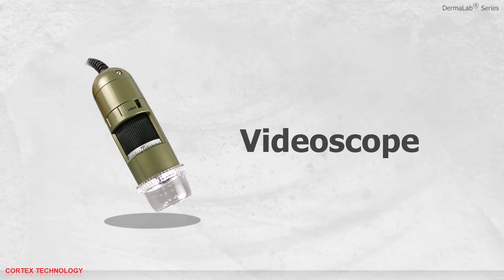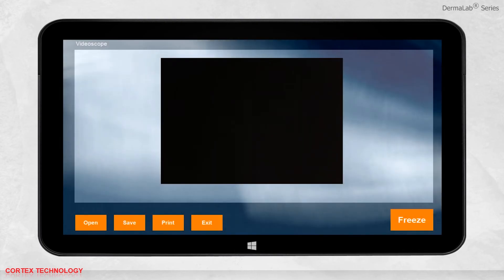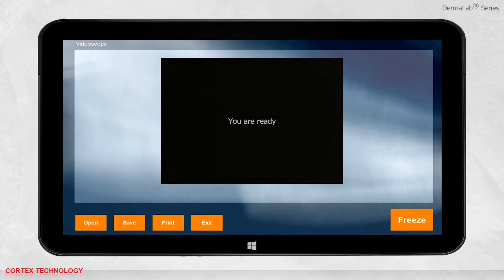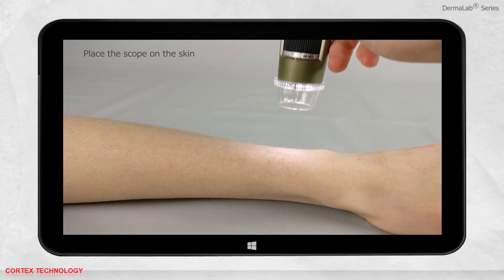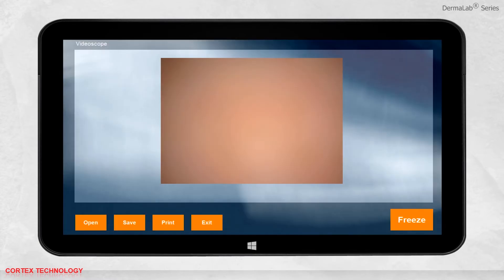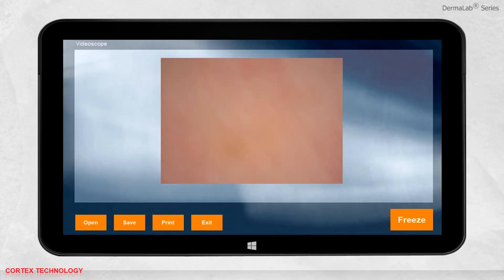Video scope application. Select video scope. After selecting video scope, the scope will light up, meaning it is ready and you can start visualizing. Place the scope on the skin you want to visualize. You need to adjust the black turned dial to focus the image. You can move it around and see the image updating.